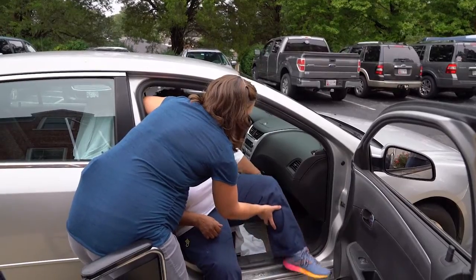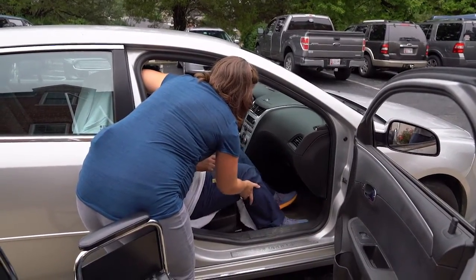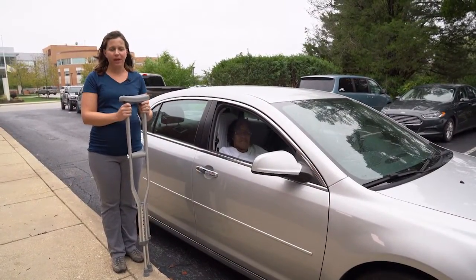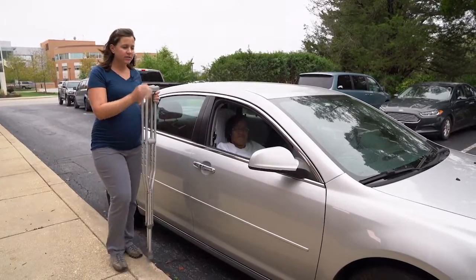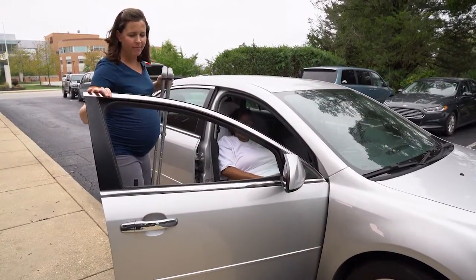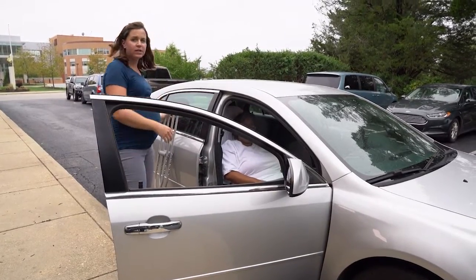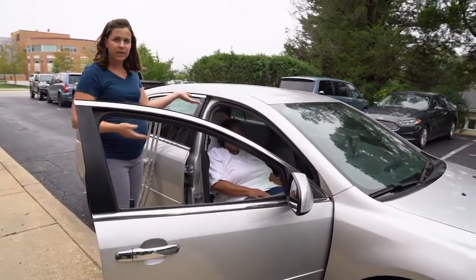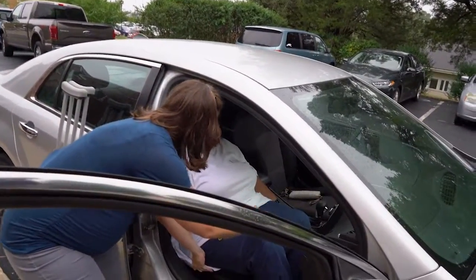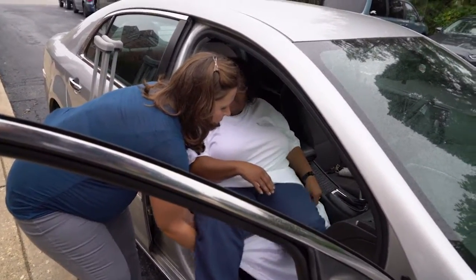But we'll always try to have the patient do what they can. Once you're home, if you're the family member helping, I want you to grab the crutches and open up the door for your family member. Roll the window down. If you've put a sheet or a towel down, you can now use that to help pivot your family member out. Okay. So we're gonna go ahead and swing our legs on out.